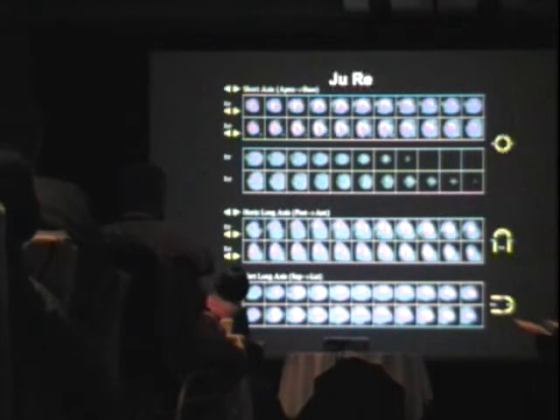You refer to the defect as PDA, posterior descending artery. In this case, I misspoke. I said obtuse marginal, but in looking at the base of the heart, here the inferior septum of the base is involved, so it is likely to be a PDA. Whether this is a left or right dominant system, it doesn't matter. Okay? You don't refer to it as right coronary territory. You refer to it as PDA.